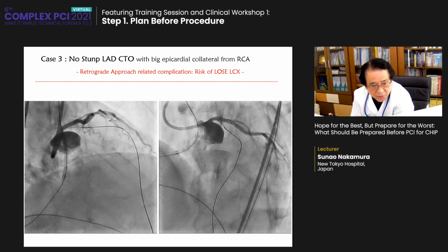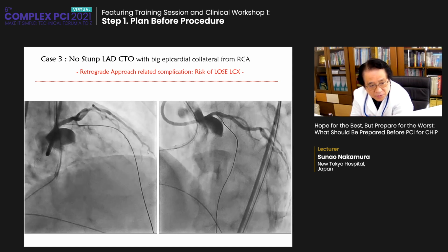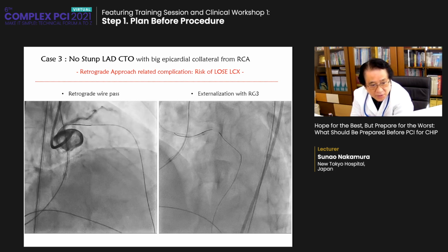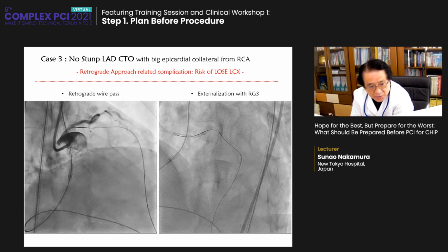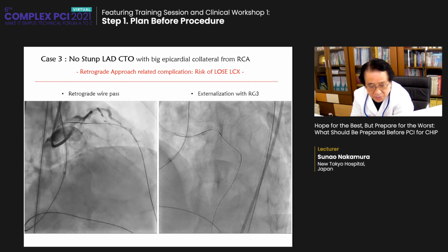Actually, the guidewire went through the big collateral without any struggle, then soon crept up to the LAD close to the exit. And then, luckily or unluckily, the guidewire went to the space of the left main. Actually, she is young enough to continue the procedure with careful consideration about the position of the guidewire until the externalization. She couldn't help herself doing like this.